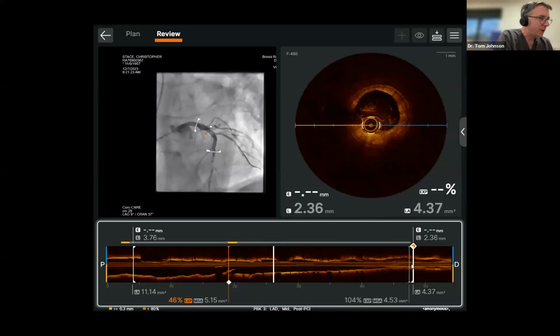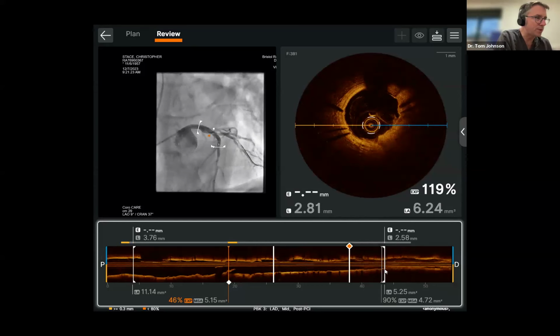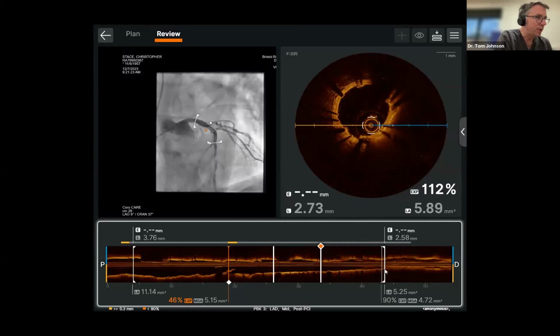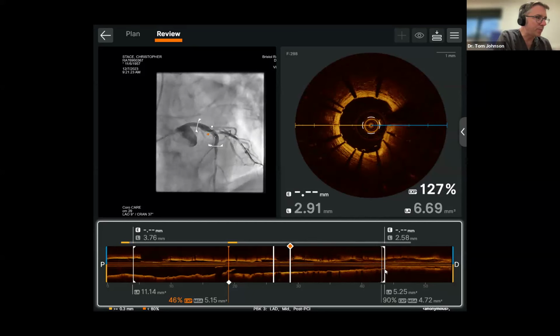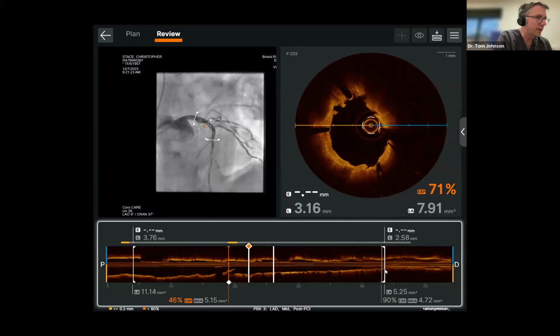So this is then the final run. And actually, rather disconcertingly, it shows even greater amount of tissue protrusion. So if we come up to that area proximal to the bifurcation, so there's the diagonal. And you see actually, if anything, more material around the level of the bifurcation.